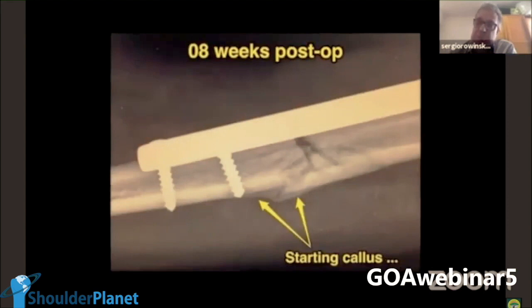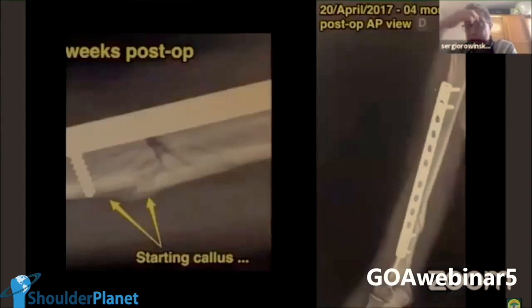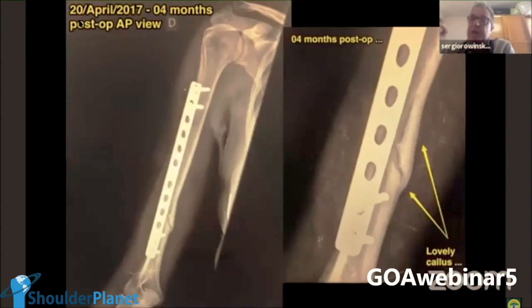The average in my practice is exactly what the literature says: 12 to 16 weeks to have radiographical healing, because clinical healing comes much first. So this is the post-op at 4 months, and people must understand that bone remodeling is something that takes months and years. This is written in Rockwood, in Campbell, and in Jupiter, all of the classical books.